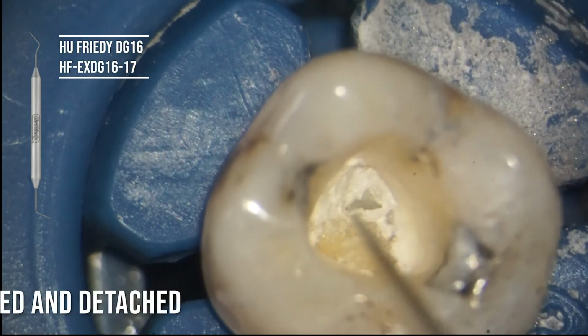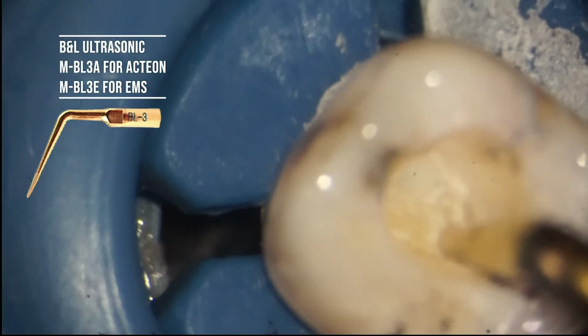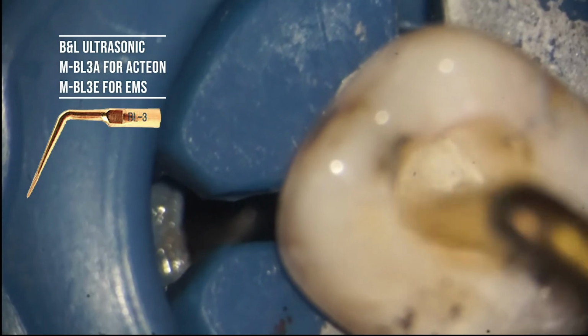We can try and remove it with ultrasonics, but it's probably a bit slow. I'm just demonstrating that here. We're going to use an ultrasonic to remove these really heavy pulp stone calcifications.